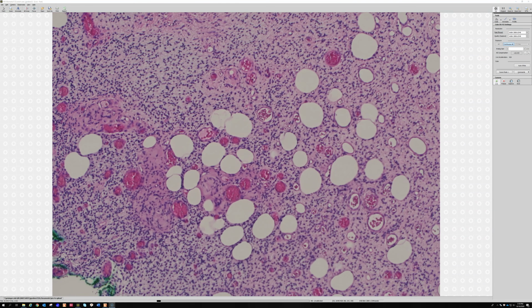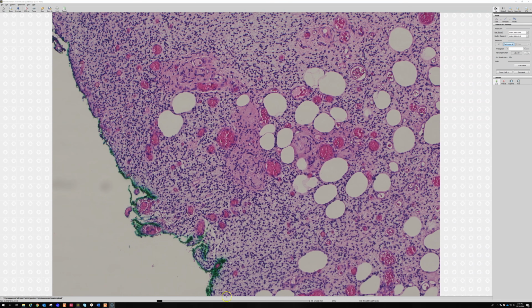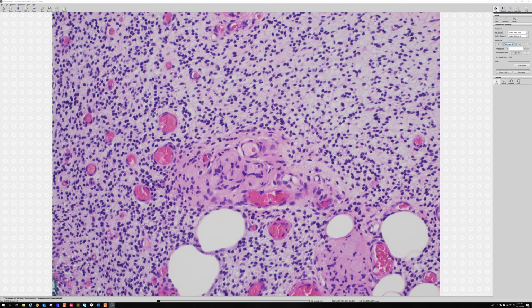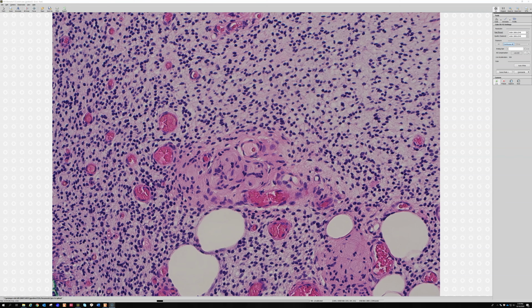And what you see are these little spindle cells that are kind of wrapping around each other, oval to spindle to round cells wrapping around each other. And in the middle, they have little pink centers that are little pink layers, like little stacked layers of collagen. You can see there's a cluster of them here, here, here. Sometimes they're single, but sometimes they're in little whorled clusters like this. And again, if you flip your condenser, you can see they're made of little flaky layers of collagen.